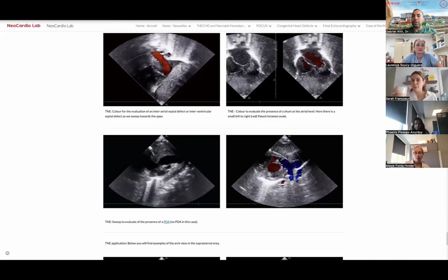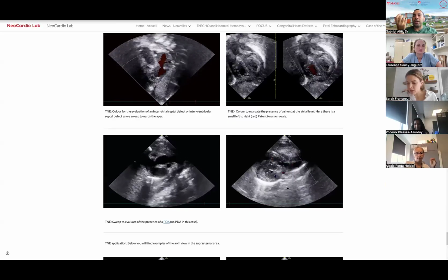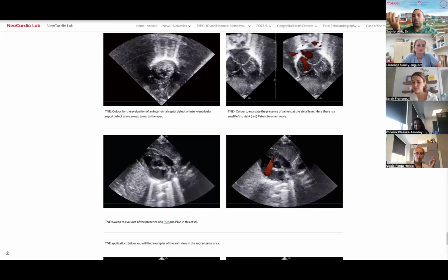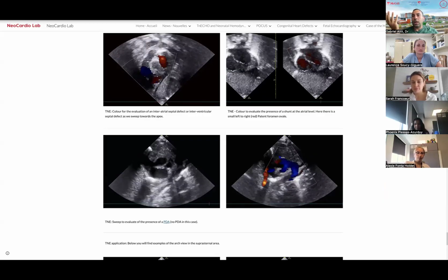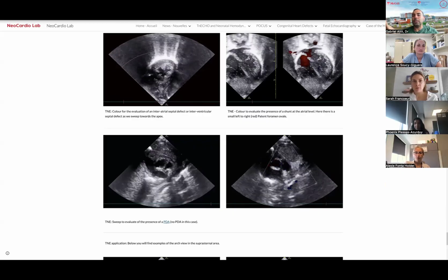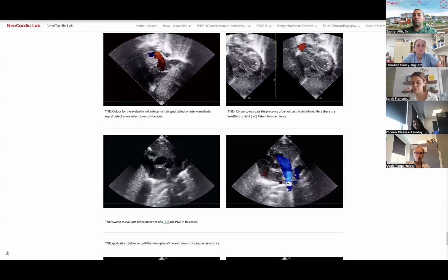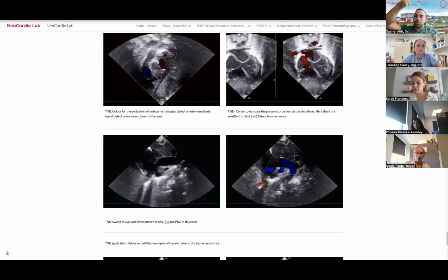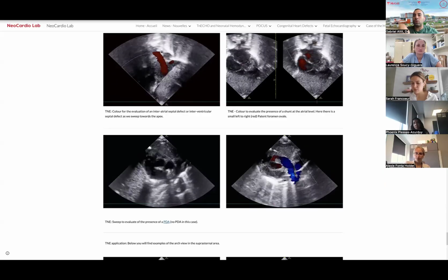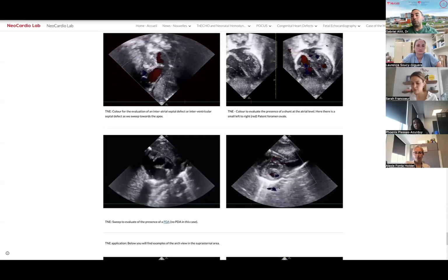You get flow because during diastole your LV relaxes, and your LV pressure typically goes close to zero. So if your aortic valve is incompetent and you're losing a lot of flow, you're going to see reversal of flow into your descending and also your ascending arch, and everything is going to be stolen into your LV. So that's often something we see more in adults.